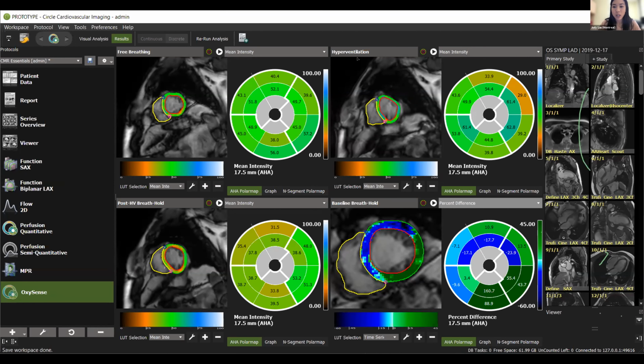Excellent. We do have a question here too. Maybe Meg or Sylvie, who are on the line still: do patients with oxygenation deficit, so presumably some sort of abnormal myocardium, underlying pathology like coronary disease, ischemia, experience difficulty in holding their breath before and after hyperventilation? Every patient is different. And so in your experience, which ones tend to have more difficulty?